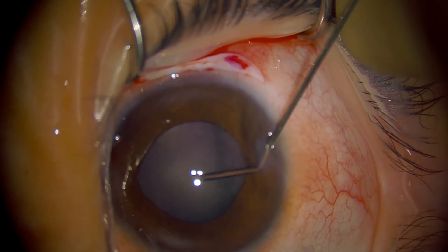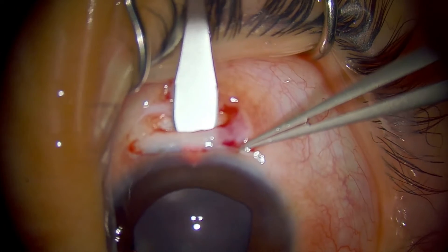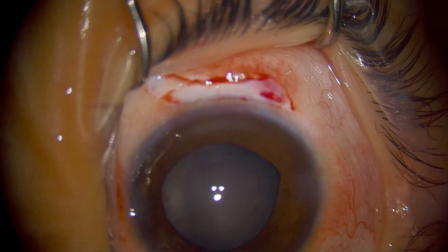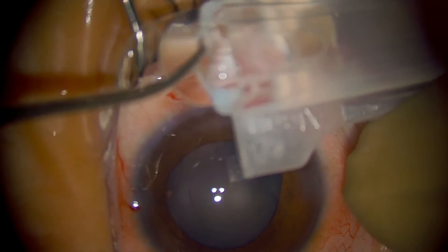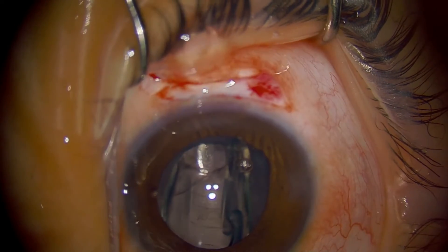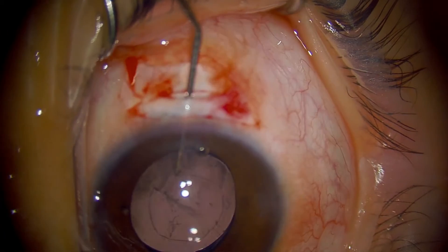We'll open up the bag. Now we're going to open the scleral incision — the only time we really need to open the scleral incision is to put in the lens. Point straight down and go straight in. This is a 2.75 incision. The bag is intact, so we're going to put the lens inside the bag. For IOL types in children, you should put in acrylic lenses — it's pretty well shown that acrylic lenses work best in children. If you don't have access to foldable lenses, then a single piece PMMA is very useful.